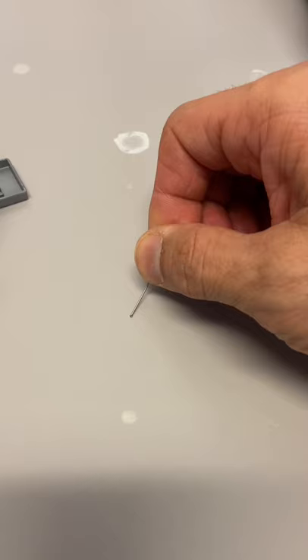Now the only reason why I stopped using these is because you can bend them. They're really easy to bend when you're putting pressure. So even with that amount of pressure, which is not a lot.